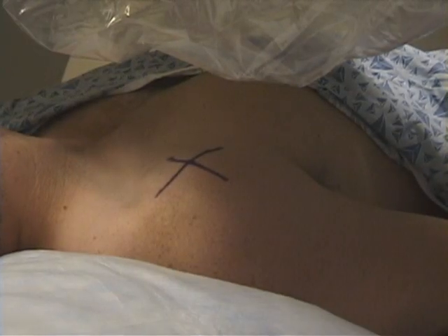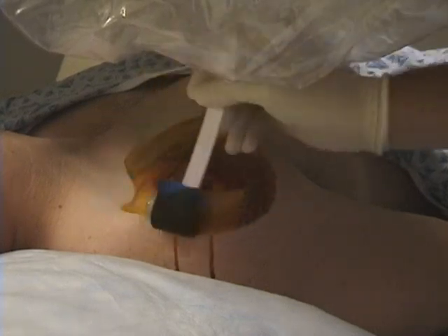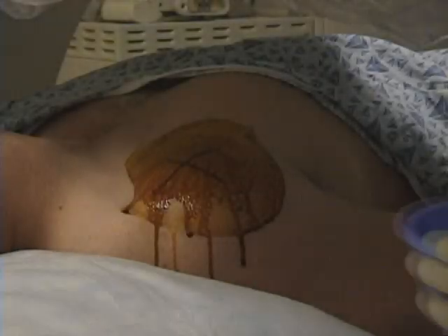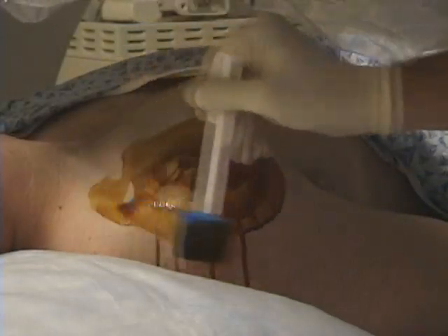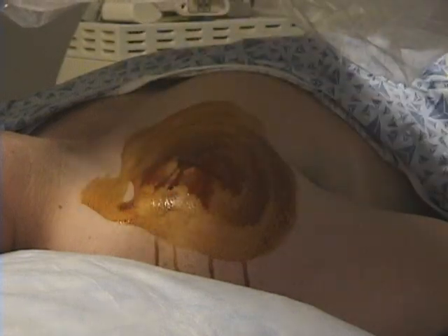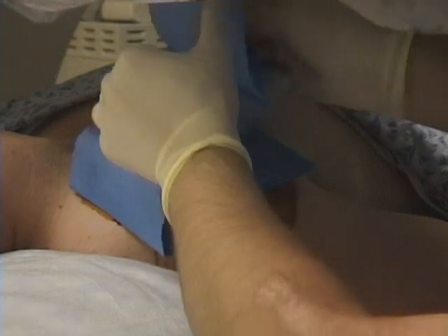You can prep the shoulder with betadyne. Use a circular path and start inward and extend outward. Do this two times. Then you can place the blue sterile field over your target site.